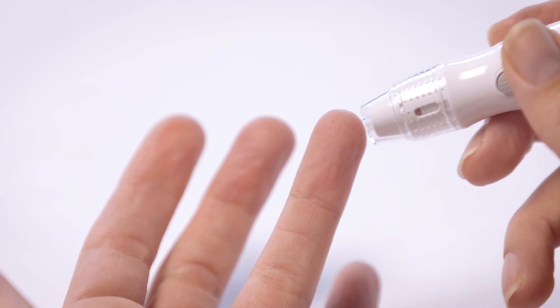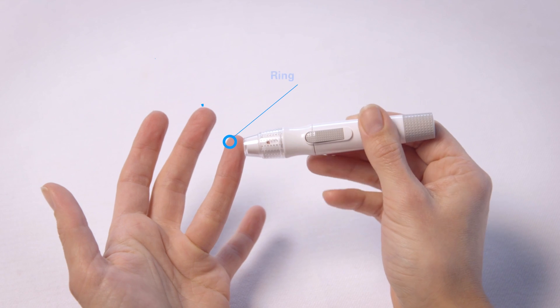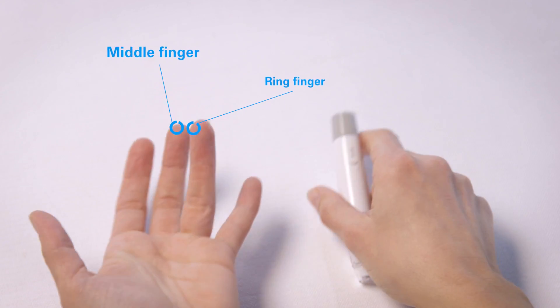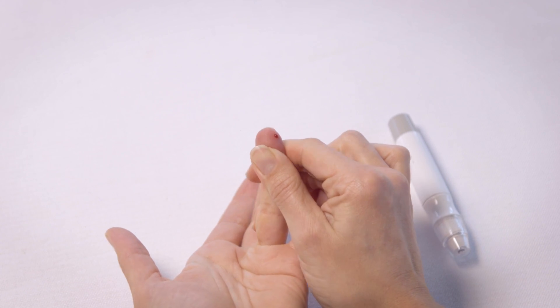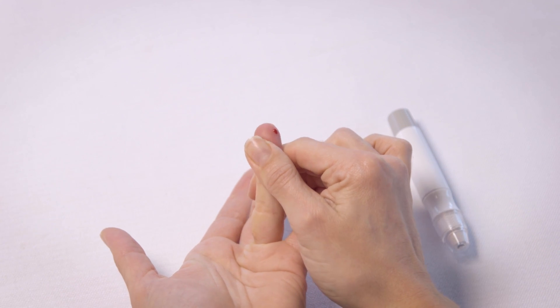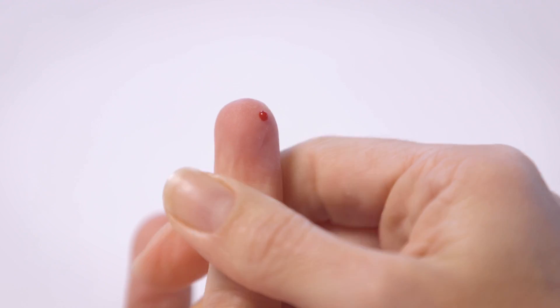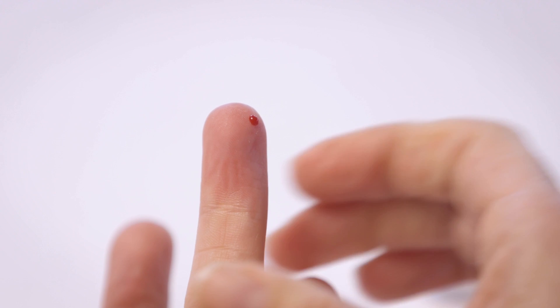Place the lancing device on the middle or ring finger and press the release button of the lancing device. Massage the finger from hand to fingertip. Take care that the blood drop has the right size and is spherical, similar to a teardrop.